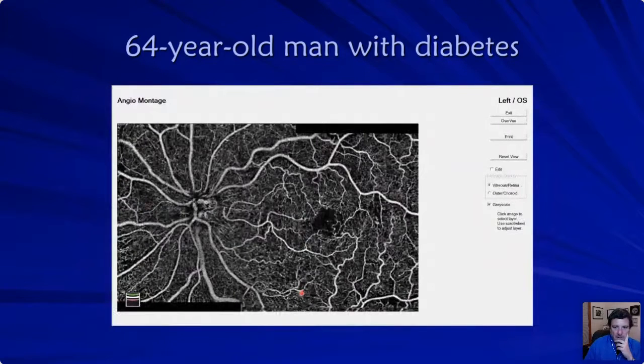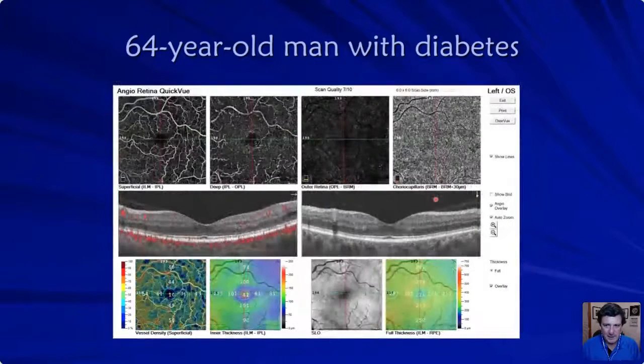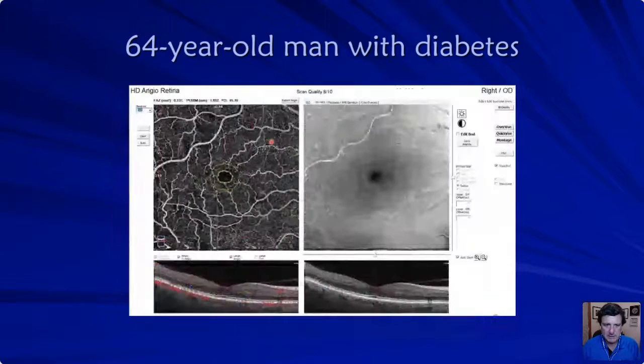There's probably changes going on. You could see the dropout, the microaneurysms. Before they had the way to measure, these are the scans that you had to use. Again, a little tough. You had to get good at it. Thank goodness for the ability to measure that's out there. And again, you can start seeing now what's happening, the dropout on this patient, measuring the foveal avascular zone.